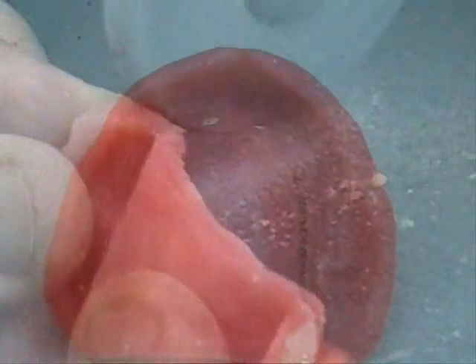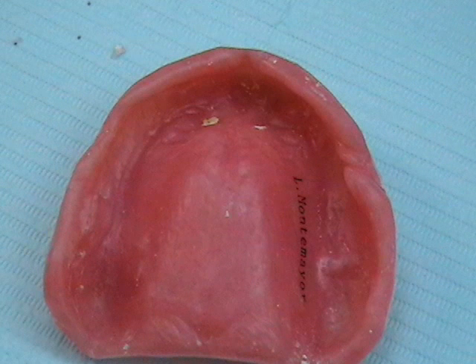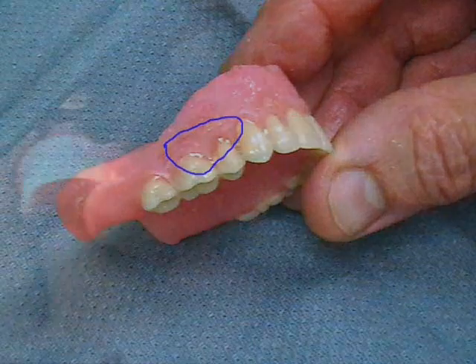The denture has been carefully trimmed and is now ready for further finishing. Small pieces of stone which remain adhered to the denture base must be removed prior to proceeding. Walnut shell pieces are used under high air pressure as an abrasive to dislodge the stone without damaging the denture base.